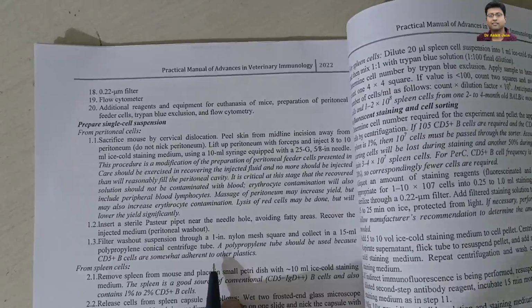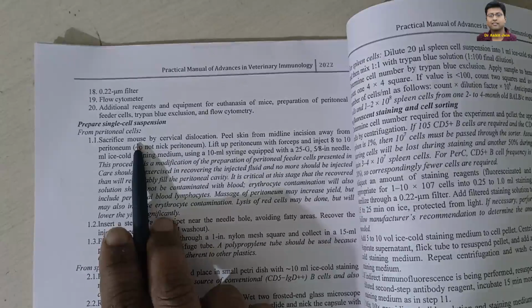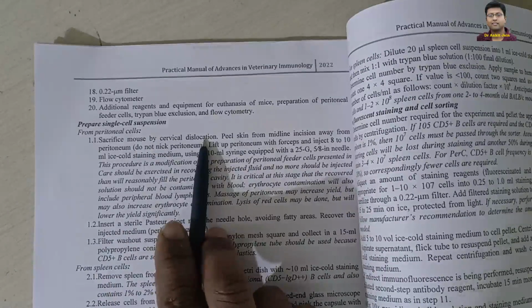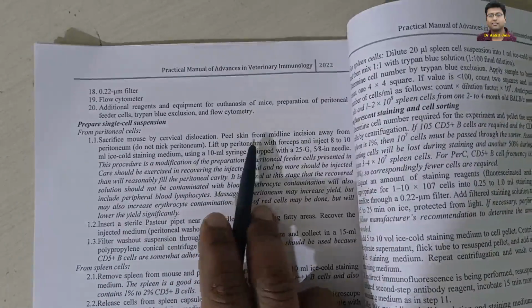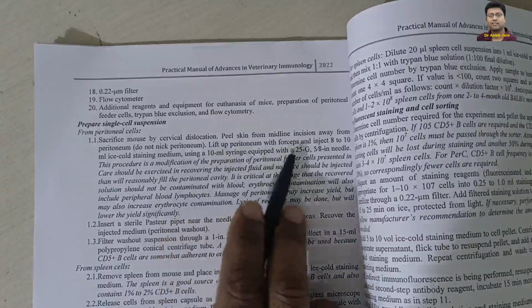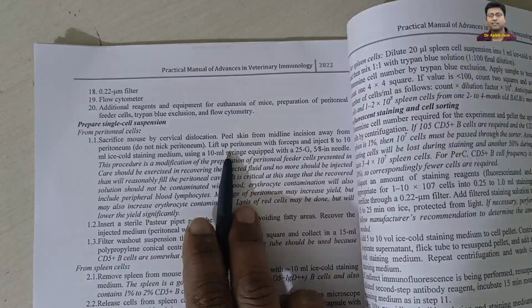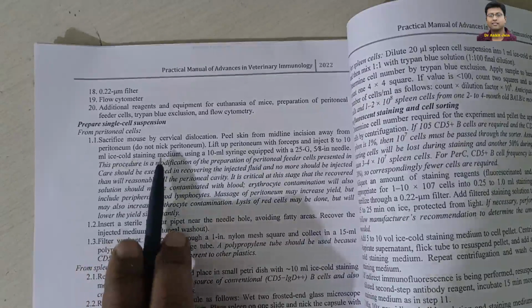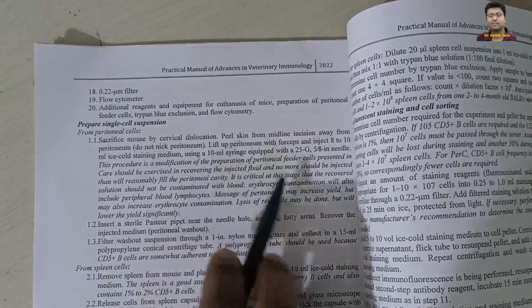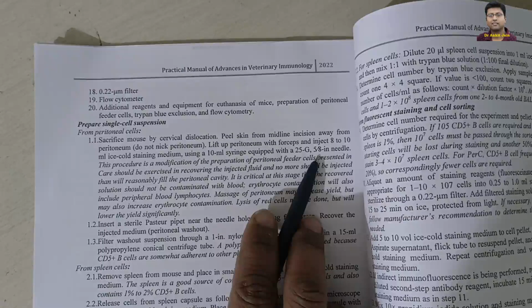So this is the procedure to collect CD5 positive B cells from the peritoneal cavity. We have to sacrifice the mouse by cervical dislocation. Then we have to peel out the skin with the help of an incision, and finally we have not to pierce the peritoneum. Lift up the peritoneum and inject ice cold staining medium with a 10 ml syringe equipped with a 25 gauge, 5 by 8 inch needle.